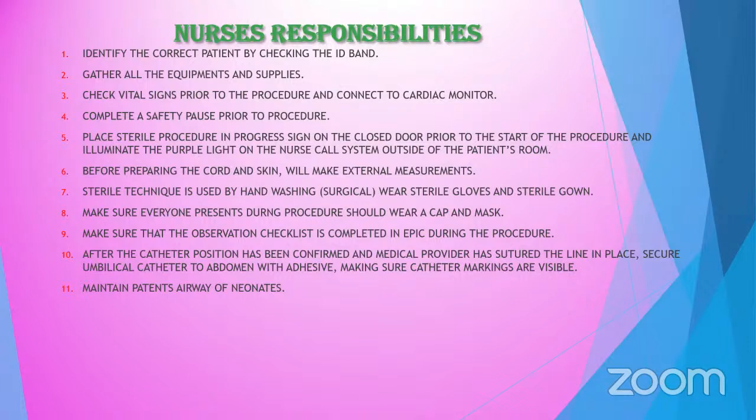Just an additional information I want to share: if the ventilator shows high pressure, there is some obstruction, maybe secretion, so we need to know that. We will check the saturation monitor and the attached saturation probe. And if the ventilator shows low pressure, there is a disconnection, so we need to check also. Just remember the HOLD: high pressure, obstruction; low pressure, disconnection.